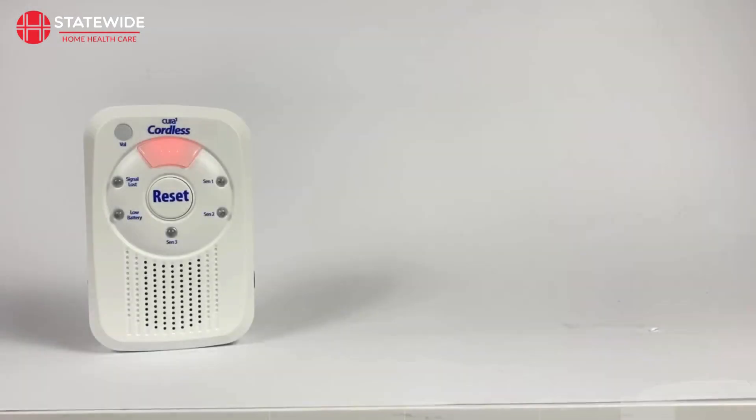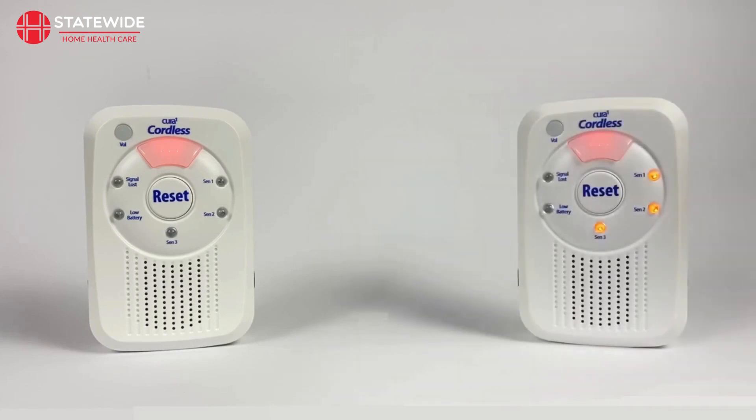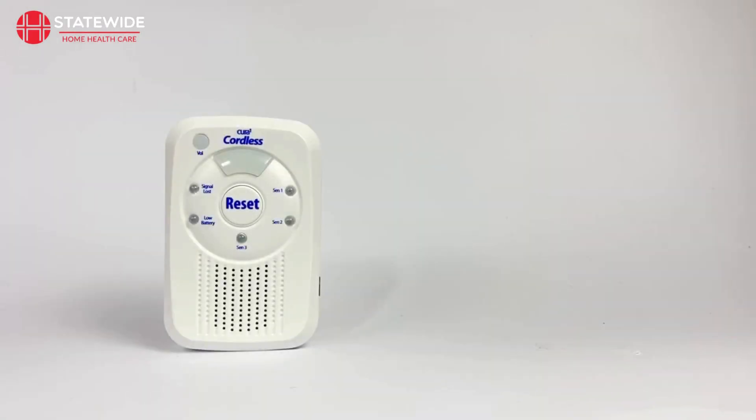When you are first setting up your monitor, it is recommended to clear the monitor's memory to ensure there are no devices prefilled into the monitor's channels. You can tell if any of the monitor's channels are filled by looking at the Sen 1, Sen 2 and Sen 3 LEDs whilst the monitor is in programming mode. If any of them are illuminated, then that channel is filled with a device. You can either clear the monitor's full memory or clear a single channel if desired. To clear all channels, make sure you are in programming mode, then press and hold the reset button for roughly 5 seconds. The memory will be cleared once the monitor beeps and the Sen LEDs go out.